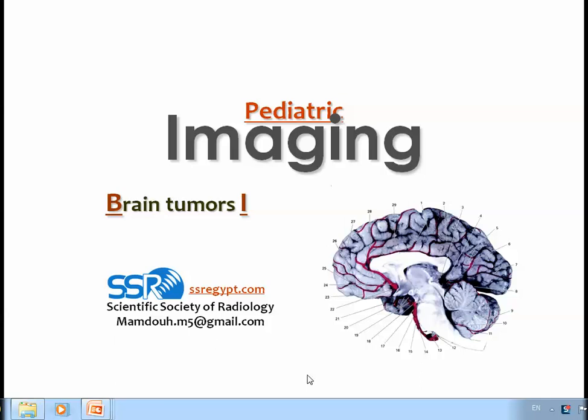Dear colleagues, we are continuing the pediatric imaging series. We have finished with the brain normal anatomy, imaging of the hydrocephalus, imaging of neuronal migration disorders. And we still have some of the important issues in the brain imaging. And this is one of them, which is dealing with imaging of the pediatric brain tumors.